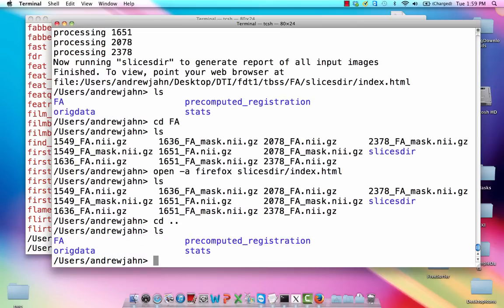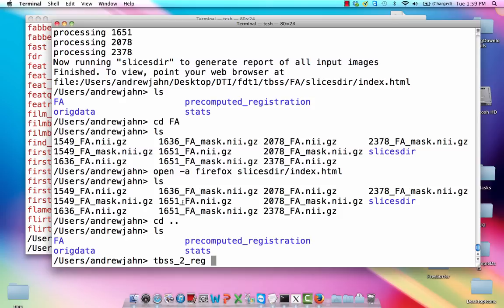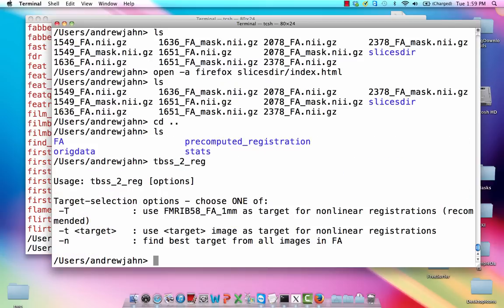Okay. So now, you would run the rest of these TBSS commands from this directory. So one directory above where all that data has now been shoveled into this FA directory. So for example, TBSS_2_reg, we would run from this directory. And notice you can take a quick look at the help. It has just a few options you can select from. And most of the time, just use the recommended. So for example, I would just give this a -T, capital T flag, to use this template that they've created right here.